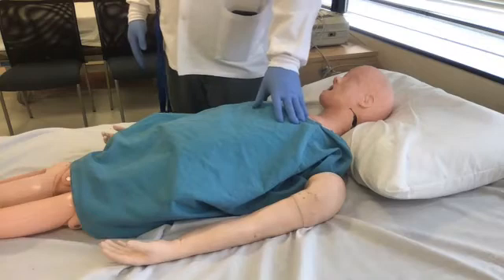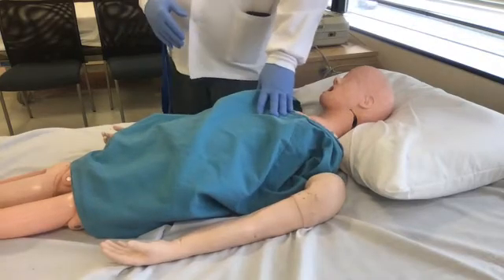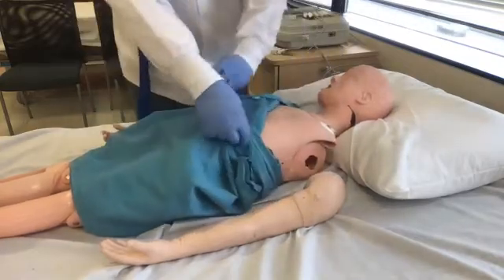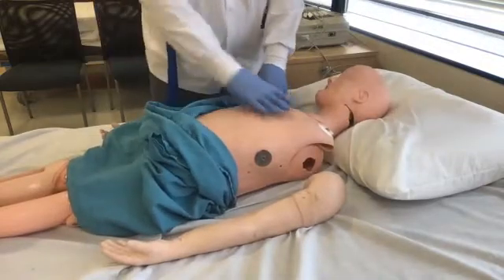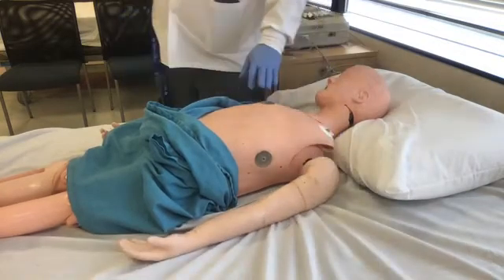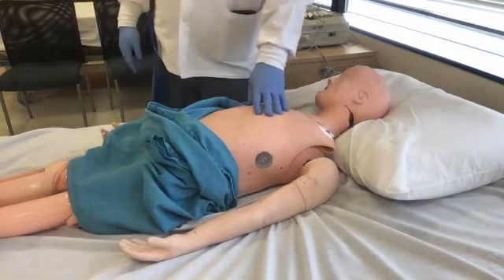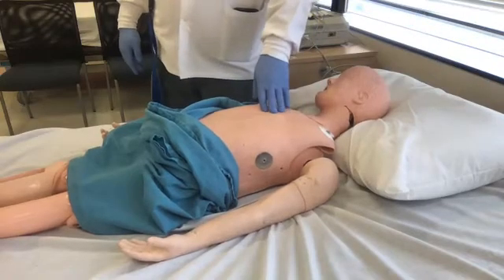So now he gave me consent. Now you make sure to tell him, I'm going to have to disrobe you from the waist on up, right? And if they have your typical lab gown, you should try to cover up their stuff right here. Now, the only thing I need is this area here. Now, if you recall, it's 12 lead ECG. The limb leads are easy. So I'm just going to jump right down to putting the precordial leads, which is V1 through V6.